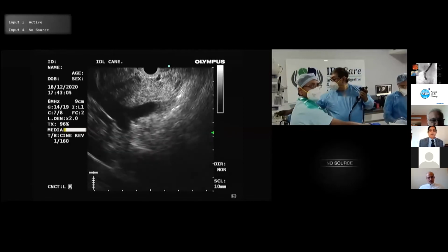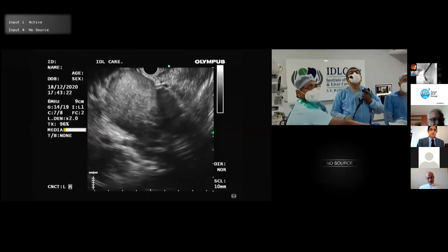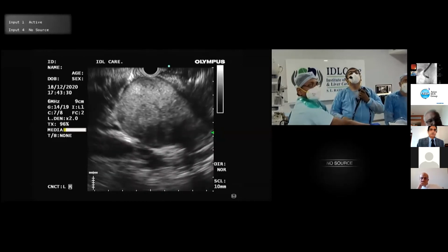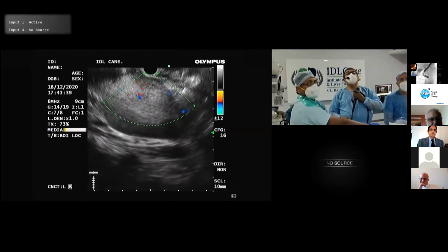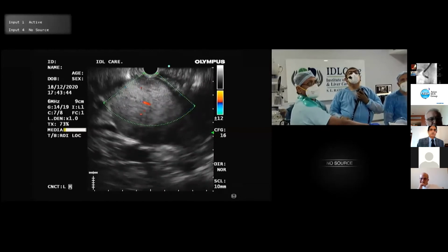So this is the head of the pancreas. This is the portal vein, splenic, superior mesenteric. So this is the head of the pancreas. Okay, chodo. And as I am withdrawing, I see this huge mass. See this again? Now here, the advantage is that there is nothing in between the mass and the duodenum. Doppler, but we should do Doppler. Okay, I think there are some thin vessels, no major vessels coming here. So this is like, in India, we have laddus. So this is like a laddu.